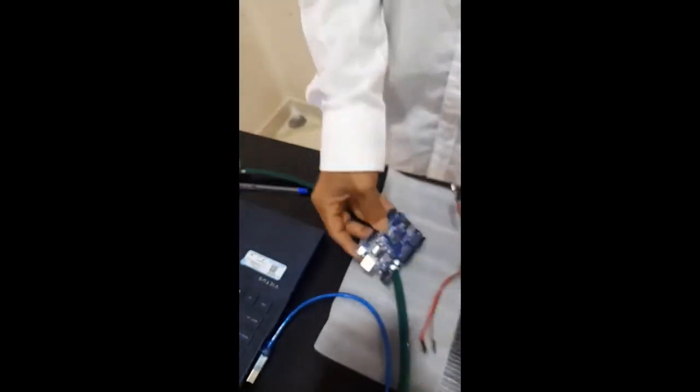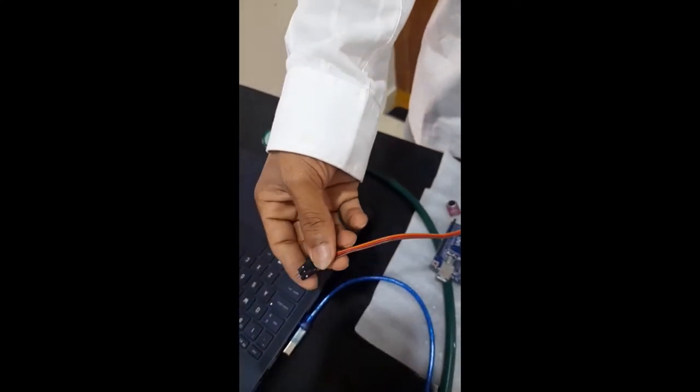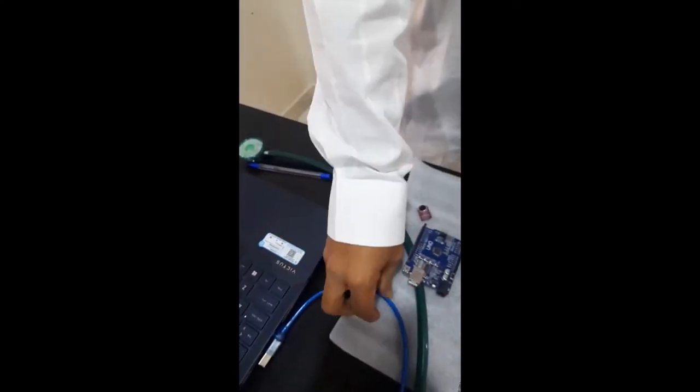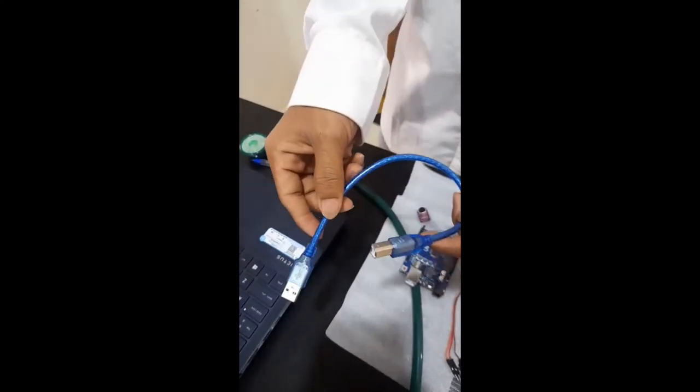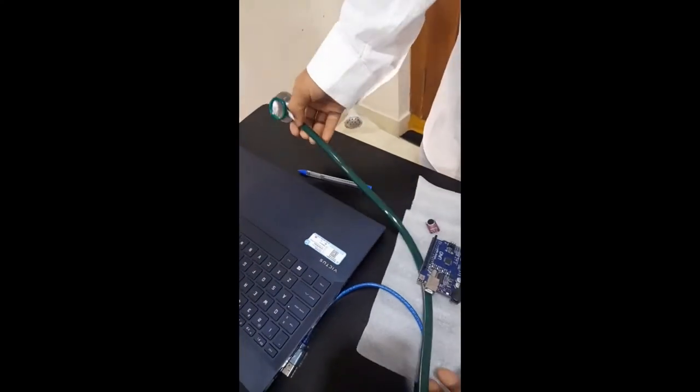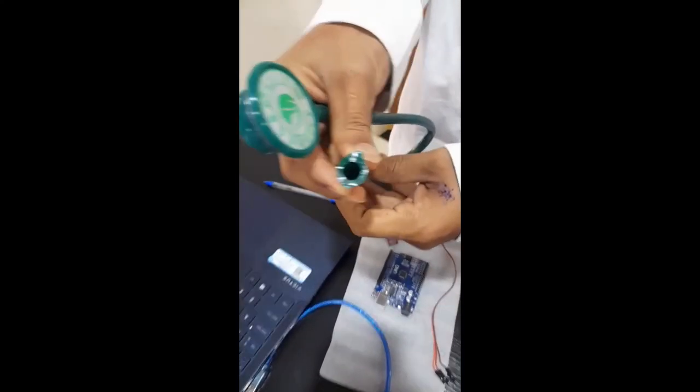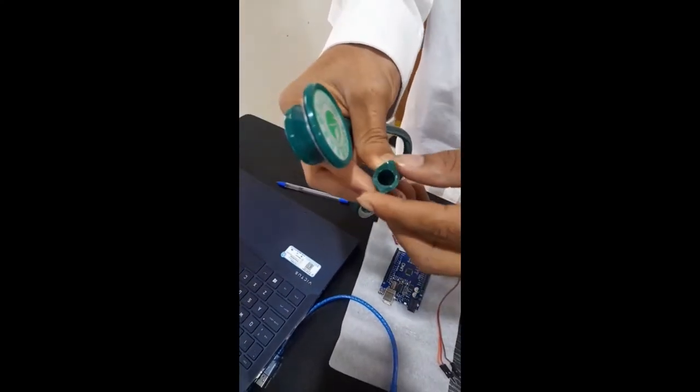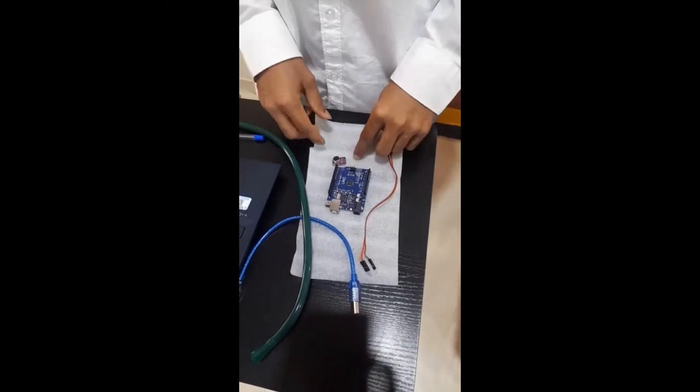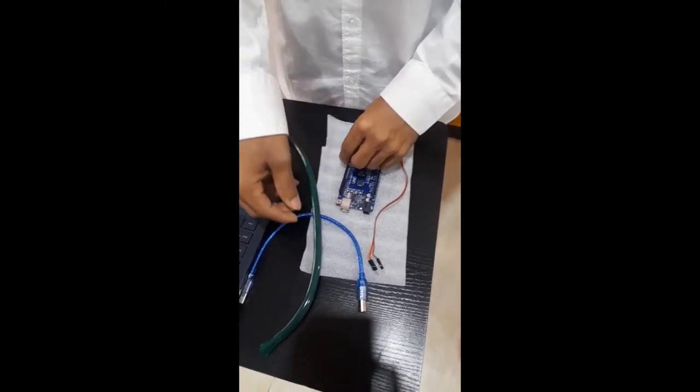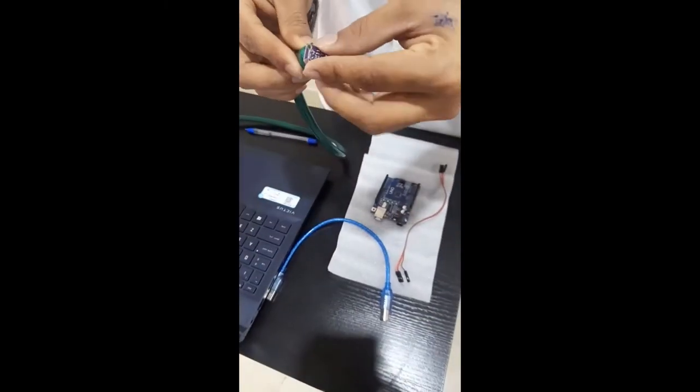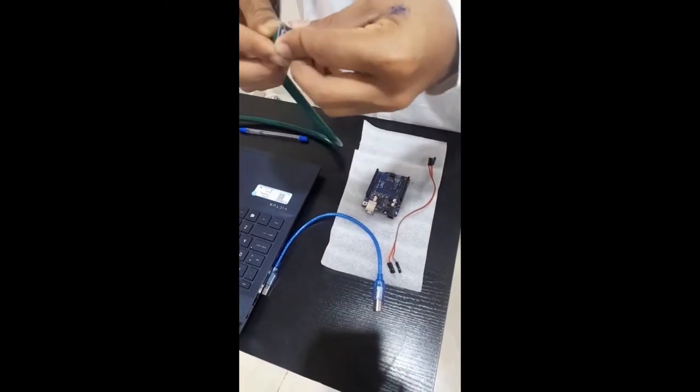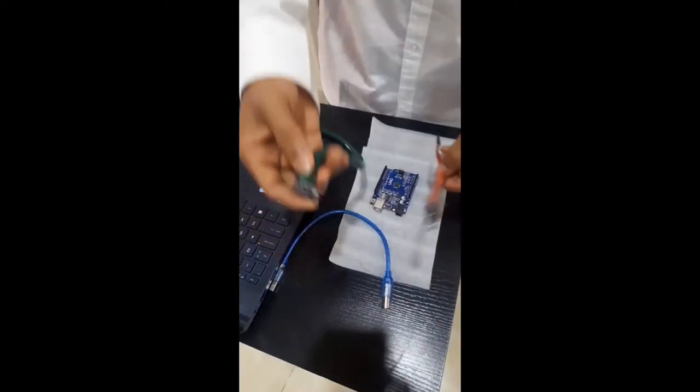Now let's see, these are jumper wires we have used to connect the microphone and the Arduino Uno. And this is a USB which connects the Arduino Uno to the laptop. I have used the stethoscope and cut it from the bottom to fix the microphone in it. Now we will assemble the parts to see the results. This is the microphone and this is the hole. I have fixed the microphone in the stethoscope.